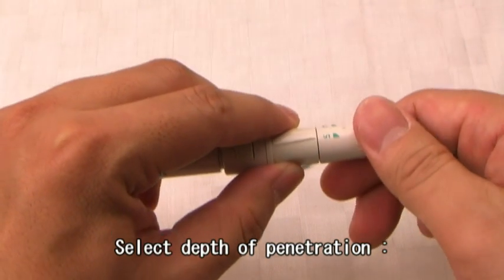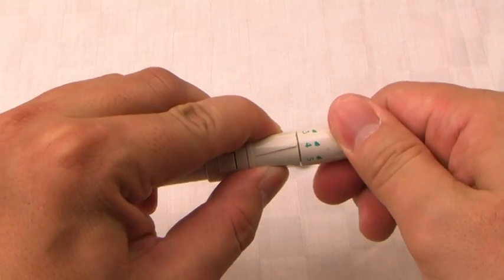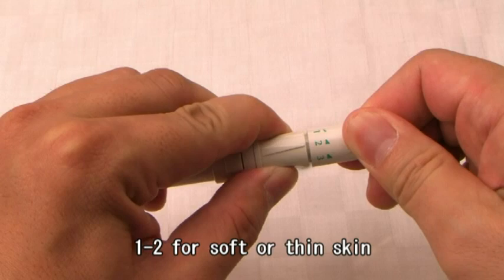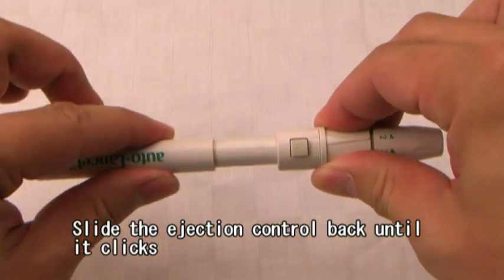Select depth of penetration: 4-5 for thick or callous skin, 3 for average skin, and 1-2 for soft or thin skin. Slide the ejection control back until it clicks.